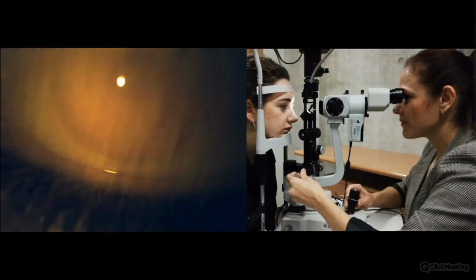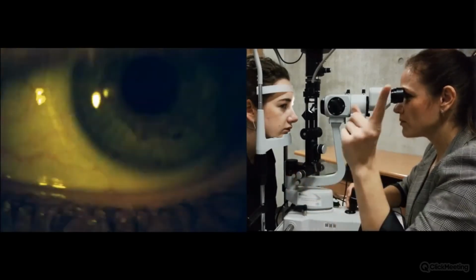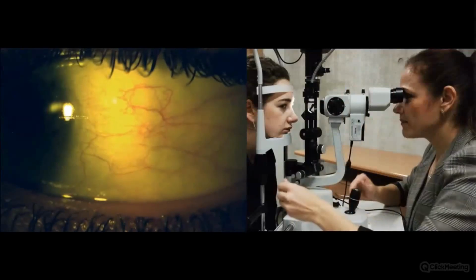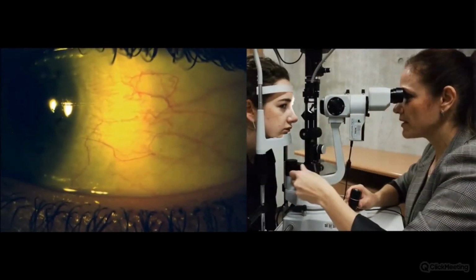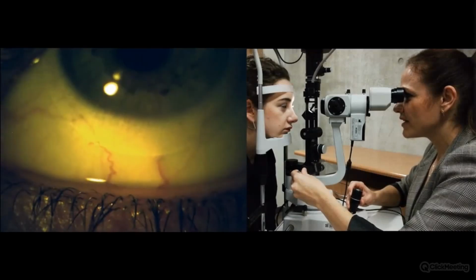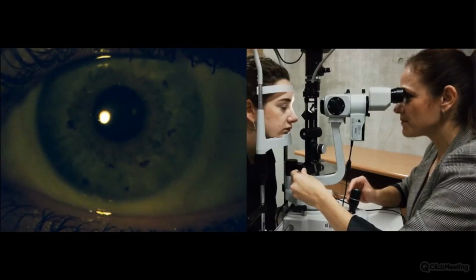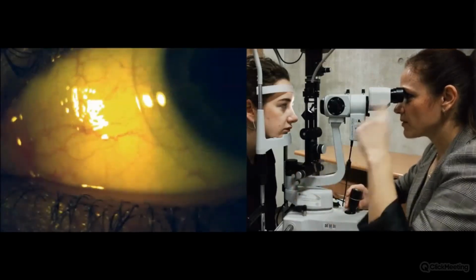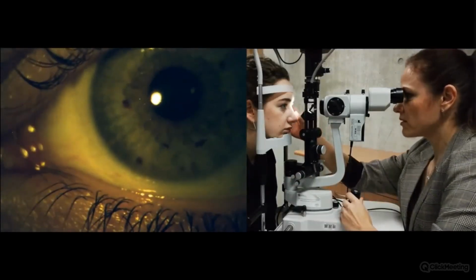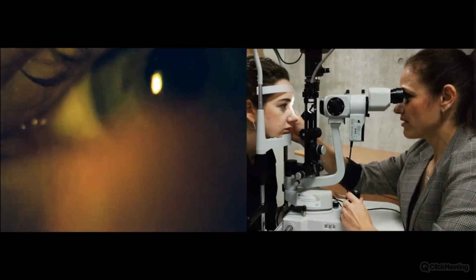Just now it's another, different contact lens. In the right eye for this patient, this was Eye Optics with a basic curve of 8.7. In this case, what I wanted to see, maybe you see or maybe not, is that these contact lenses are moving less than on the right eye. The movement on upward blinking is less. It's not 1 millimeter or 1.5. It's less than 1 millimeter, maybe around half. But what I wanted to show you is that this lens is a little bit tight for this patient.